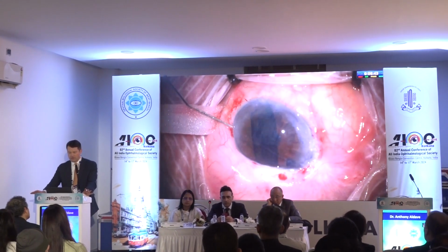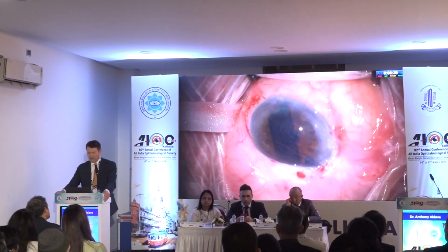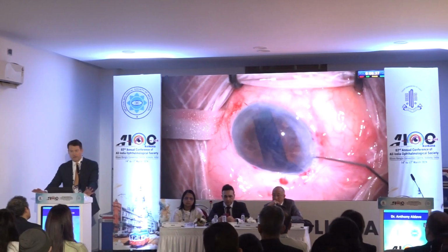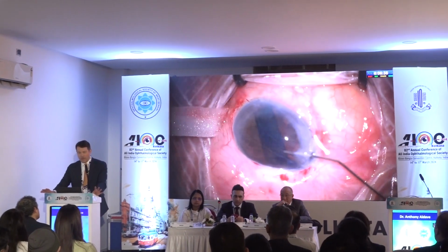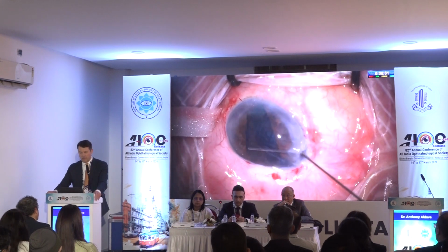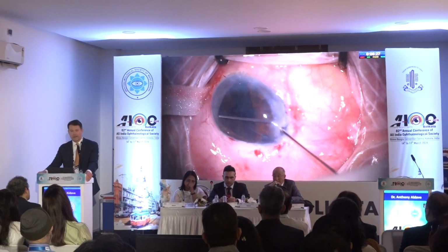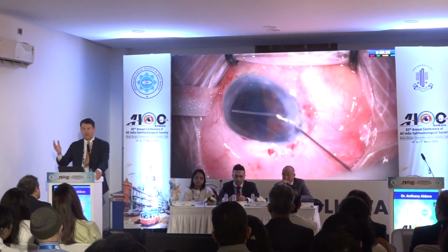Stopping, shallowing the chamber again. Here you see drawing some fluid out. In this case, it's just not unfolding. So what I recommend in these eyes, take advantage of the depth of the chamber and use this direct manipulation technique with your cannulas. Here we're touching the stromal side of the DMEK to unfold that leaf. Much easier than trying to tap it out.